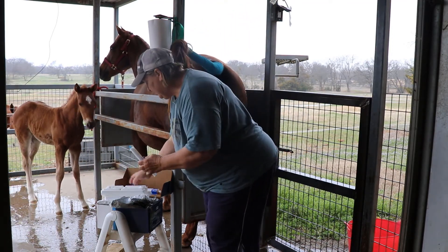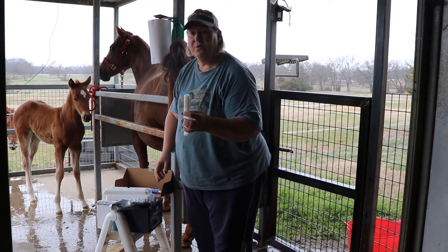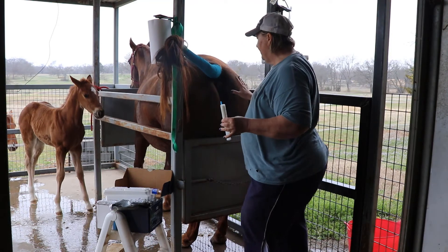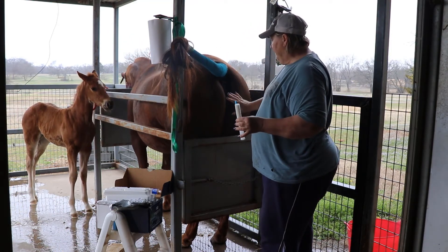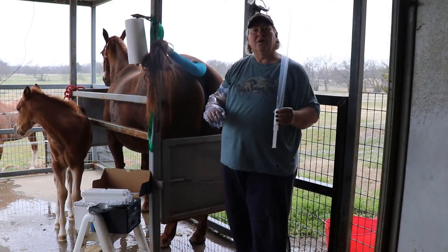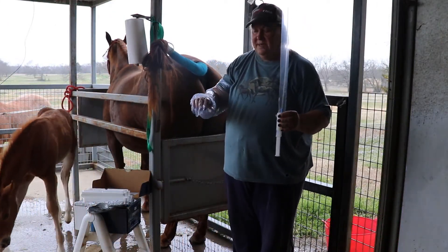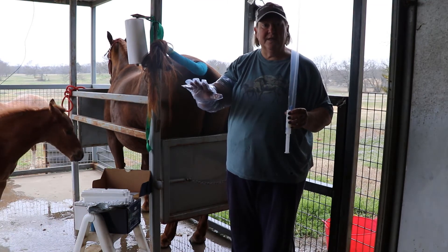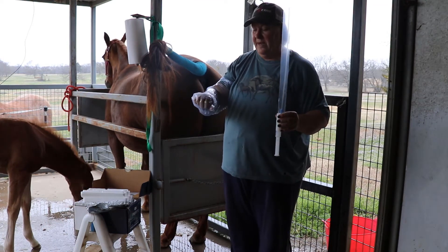So at this point we're going to proceed with doing the insemination. We've already cleaned the mare up and got her tail secured so there's no bacteria in this area. We have a sterile sleeve rather than the normal sleeves that we use to palpate.